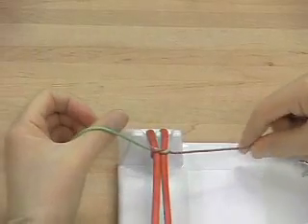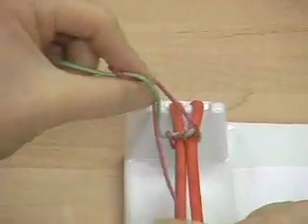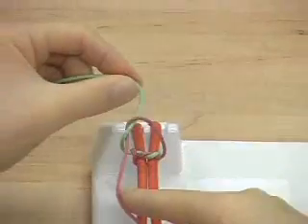The thumb of the left hand is brought up underneath, encircled pincer created, limb retrieved, and brought through the knot and laid down in a square position.